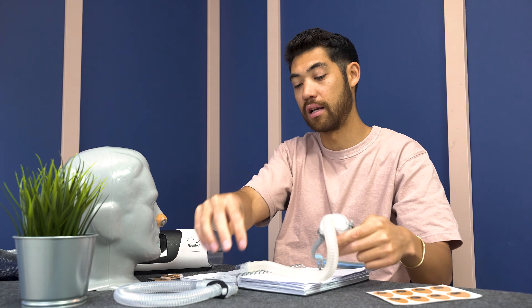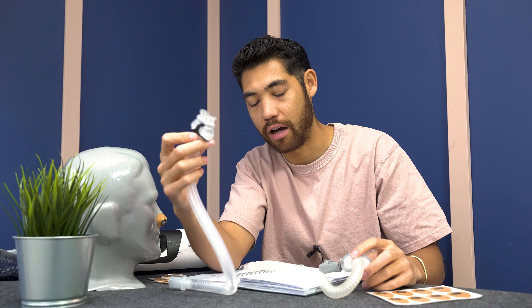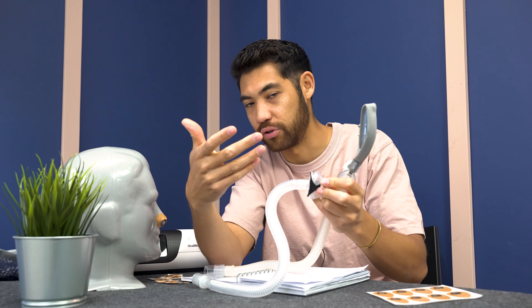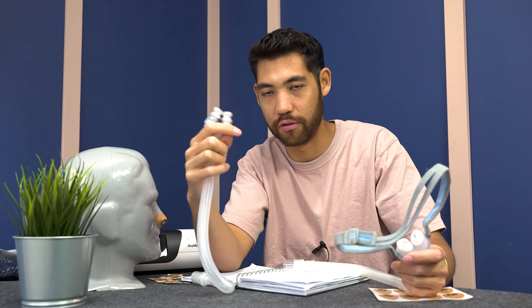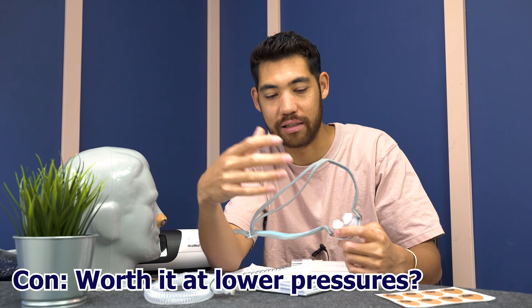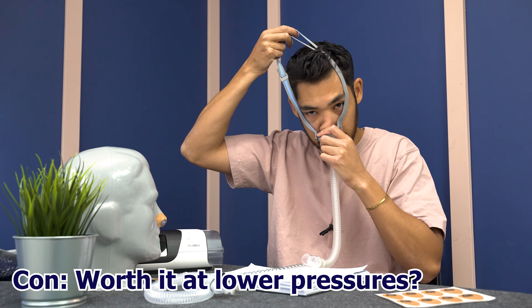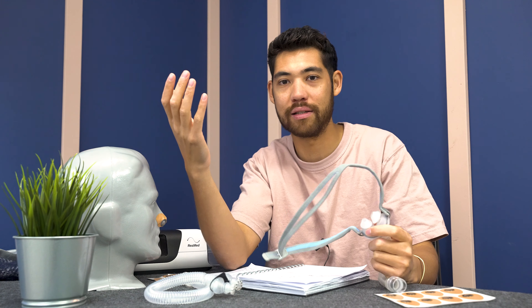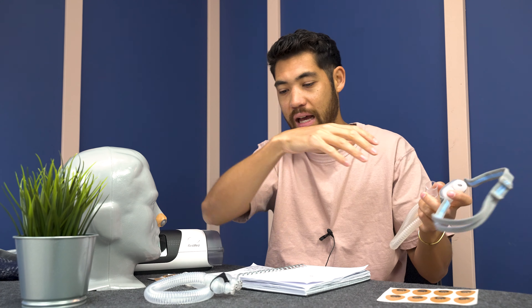At high pressures, I think it's a no-brainer between this and a P10, because the diffuser on the Bleep is a lot better. It's a lot easier to exhale at higher pressures than the P10 because the holes are bigger and the softness means no wind but still easy exhale. However, if you're on lower pressures and never really seeing leaks on a P10 — maybe you're a back sleeper who doesn't move around a lot — maybe the P10 is still fine. The P10 is a lightweight mask and once you get used to it, it feels like nothing. If you're never having leaks with a pressure of around 4 to 10, I'd probably just go with a P10 since you wouldn't have to buy halos. But at higher pressures, the Bleep shines even more.